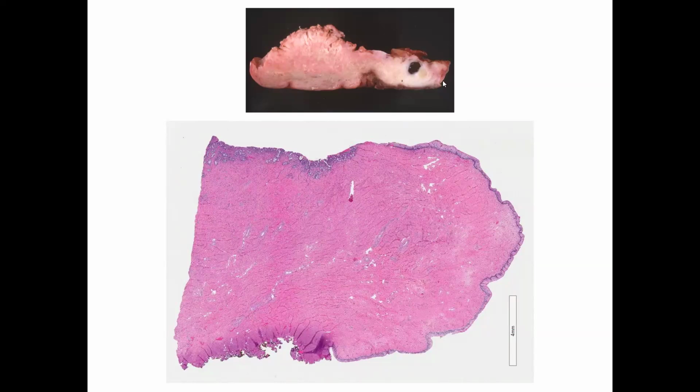Where is the surgical margin? This is a surgical margin. The tip here is the vaginal surgical margin, but this surface here is also the anterior pericervical surgical margin, and you can see here that it is rugged and it is cauterized.